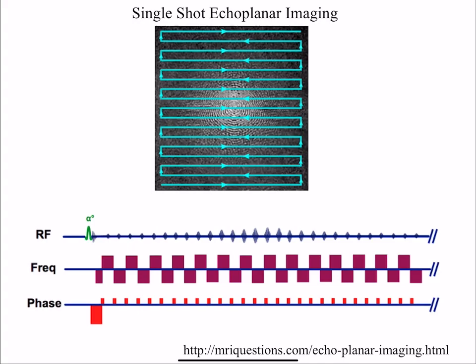People have tried to use FLASH, and there are still attempts to use it, and people are coming up with new methods all the time, but I would say 99% of fMRI still uses this sequence because it works so well, and it's well supported. Okay.